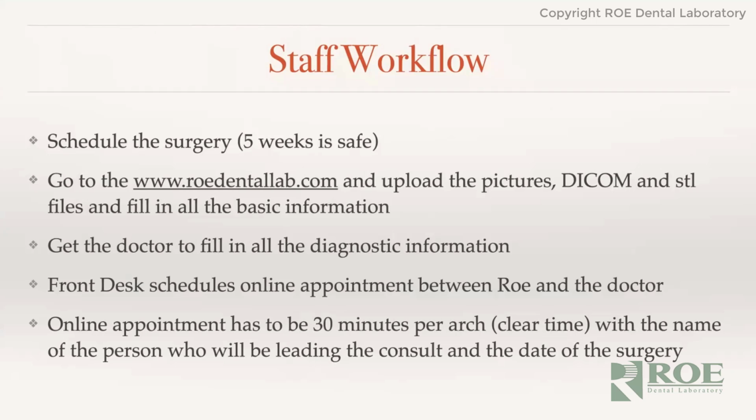This has to be clear time. It usually occurs in what is the lunch hour, even though a lot of us don't take lunch. You have to have this as clear time and time to set aside to really go over everything in depth and make sure that the implants are placed where you like them to be, the prosthetic design is what you want it to be, and to make any changes at that time.